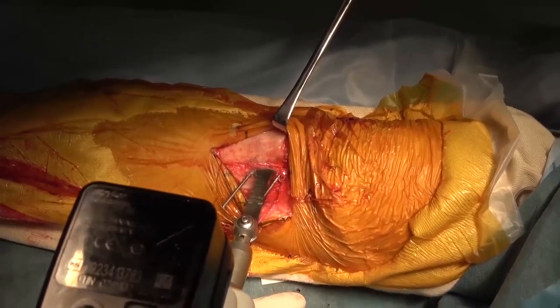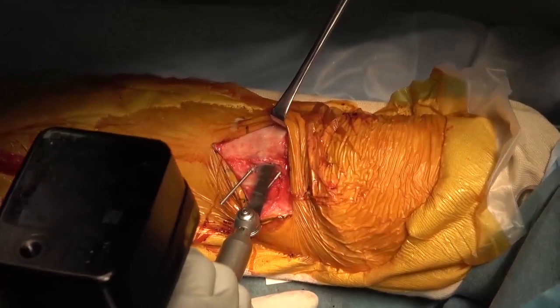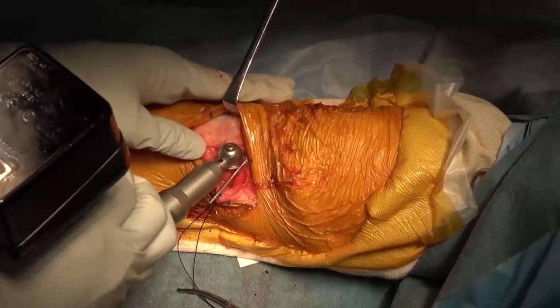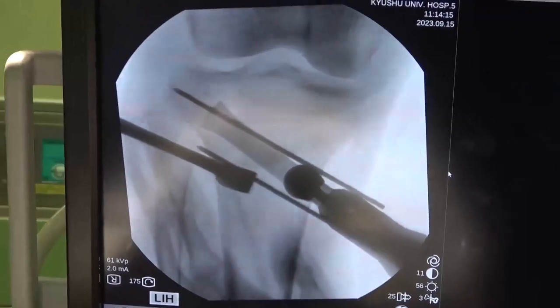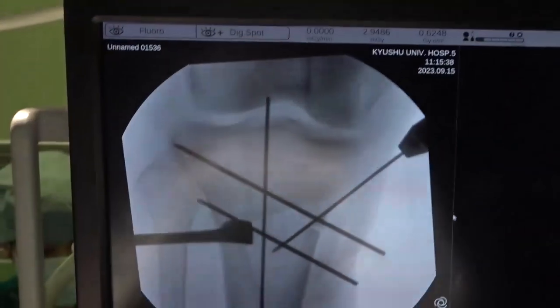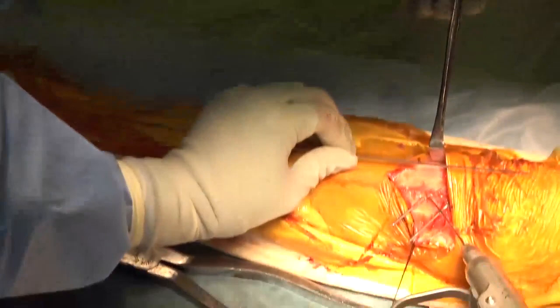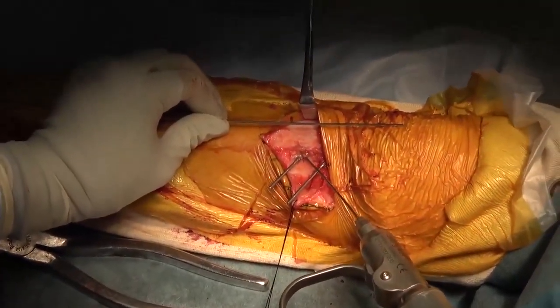The descending osteotomy is initiated from the medial cortex up to the second guide wire, while maintaining 15 mm thickness of the tibial tuberosity using a long micro-bone saw or a thin reciprocating saw. A 1.5 mm K-wire is introduced at the same point as the third guide wire and at a 45-degree angle across the proximal tibial bone axis as a reference for the distal end of the descending osteotomy.